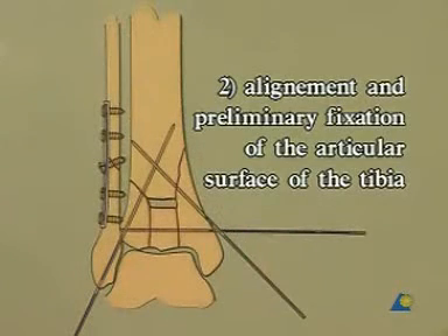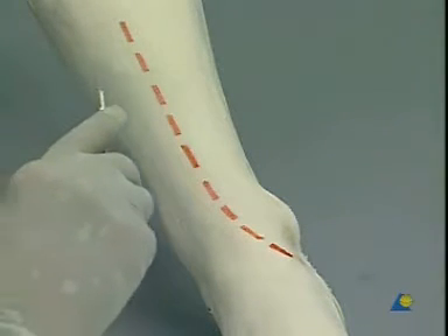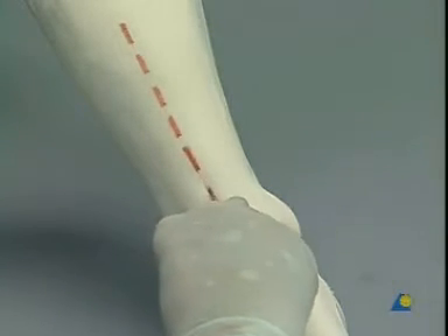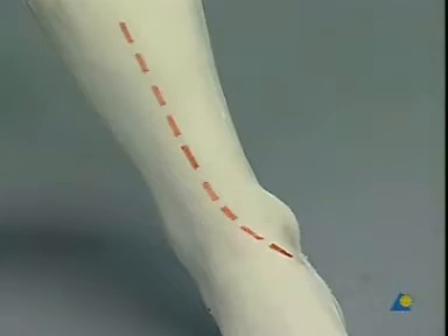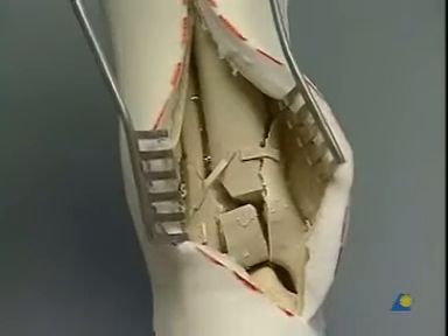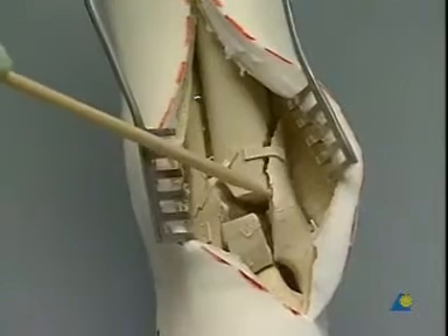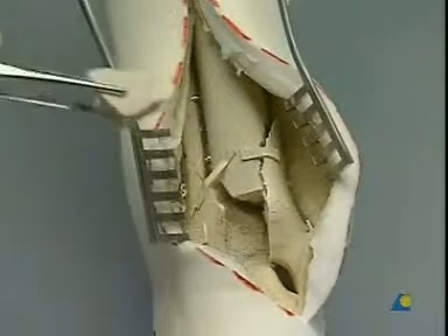Second step: alignment and preliminary fixation of the articular surface of the tibia. We approach the distal tibia through a straight incision starting laterally to the tibial crest. As we reach the level of the ankle joint, we gently curve in the direction of the medial malleolus so that our exposure permits a good look into the articulation. The fracture fragments are identified and cleared of hematoma. In order to get a better overview posteriorly, the loose anterior lip fragment is temporarily removed.